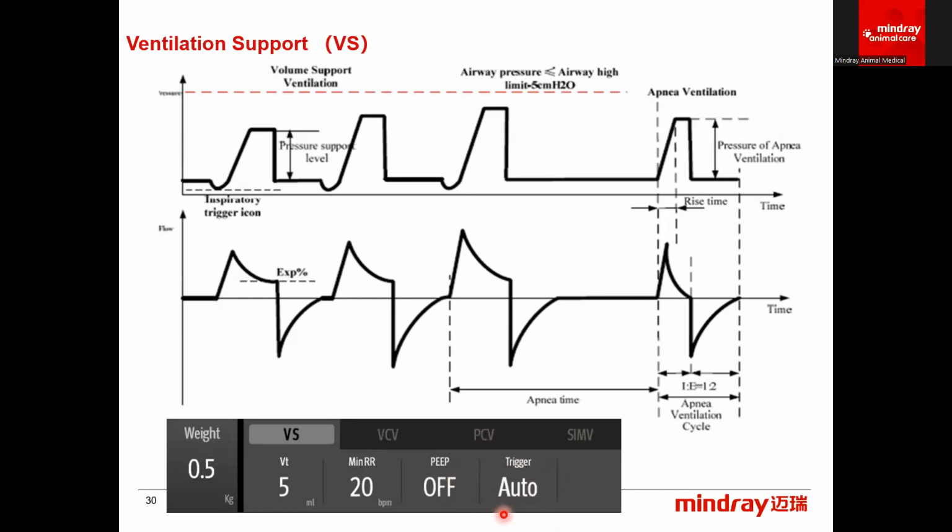Because if your patient is taking 22 breaths per minute and they are very puny, poor breaths, we don't want to be supporting every single one of those, because then your patient's going to be hyperventilated. We only want to support the good breaths, right? So we can see here our airway pressure, our pressure support, is starting out low to try to reach our ideal tidal volume through here.